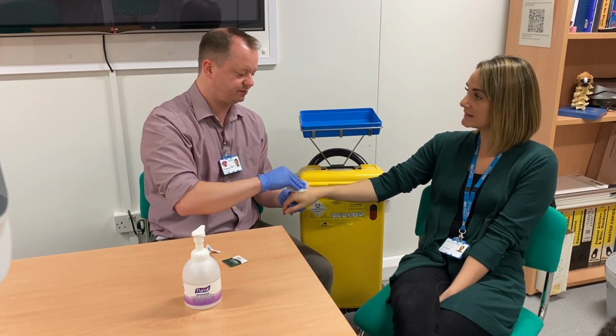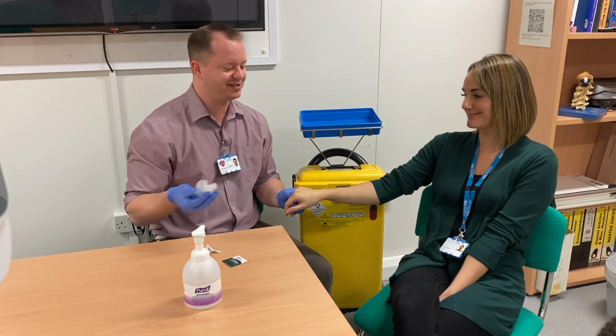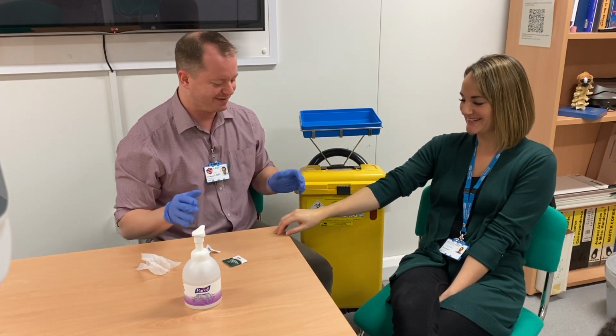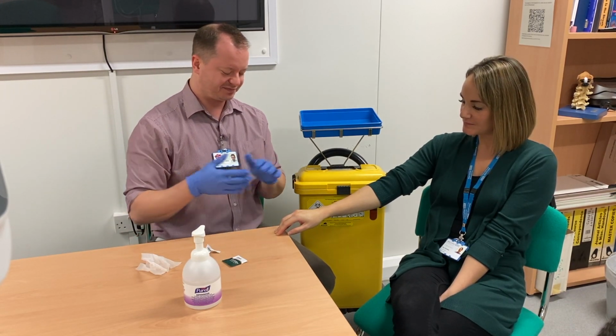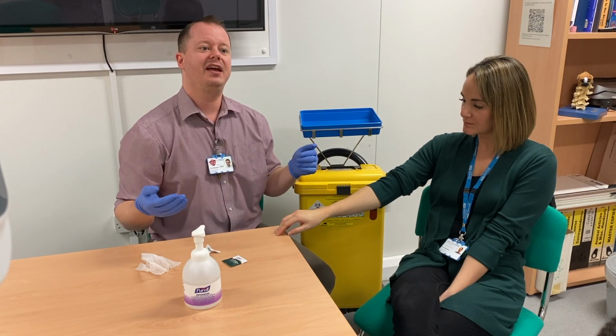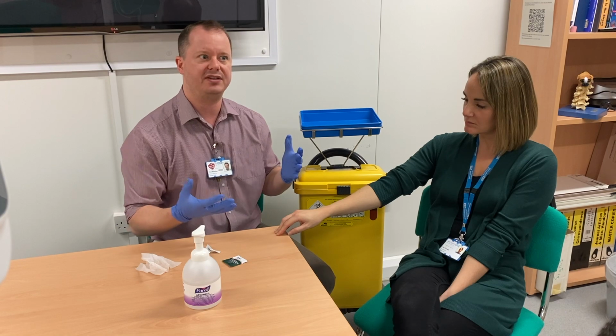I'm very clean. You are very clean. Now, try not to look at your wipe when you come away from it, just to see if there's anything come off there, which is a habit I must try and break myself, but I do try every day to break that habit.